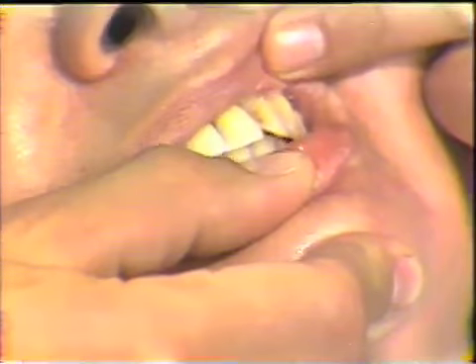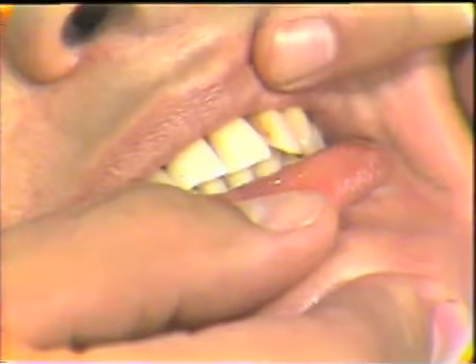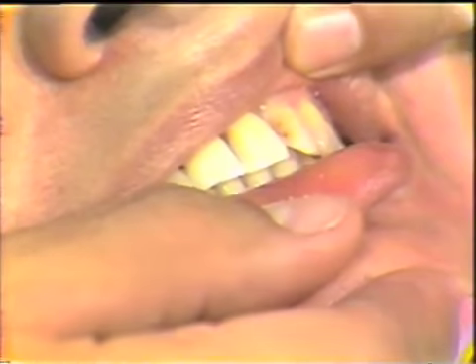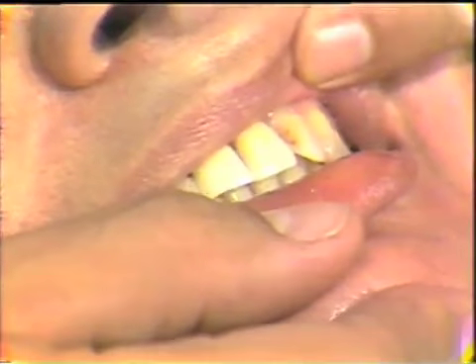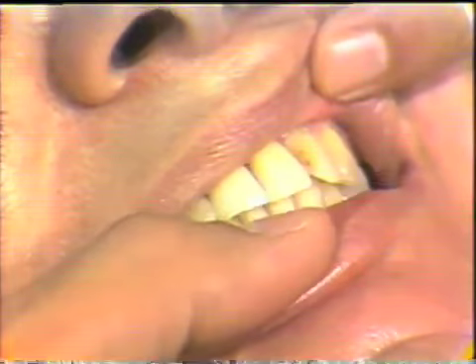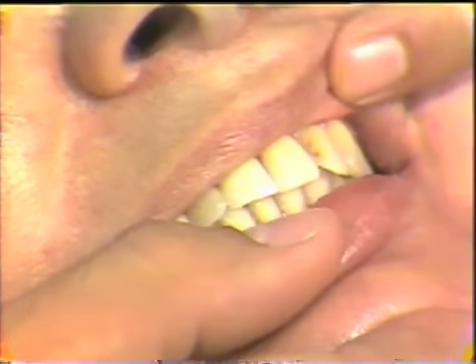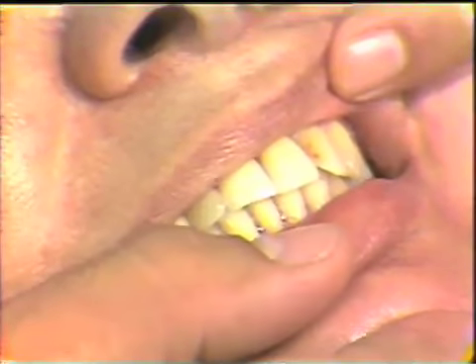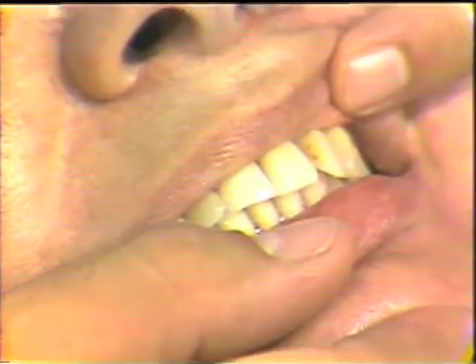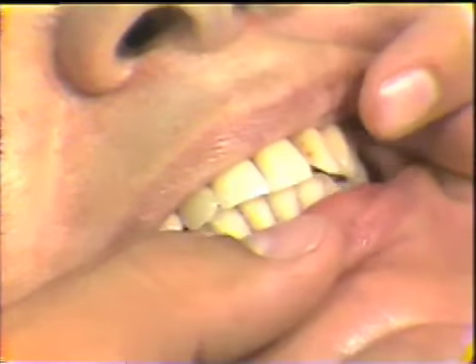Till you just touch and then squeeze. There's a real small slide between centric relation and centric occlusion on this patient. So there's a real small discrepancy, but we should know exactly that relationship, because if we're to put in an appliance that is going to do no harm whatsoever to the mouth, or trying to put in an appliance that is stress-free, we're going to have to accommodate to the adjusted position. And we may choose, in this case, to do an occlusal adjustment on this patient.